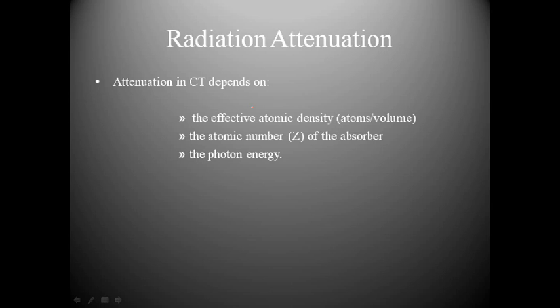It has attenuated more X-ray photons than the bone, the air, and all of the other structures in the pelvic area. The material the belt buckle was made of has a very high Z number, and because of that it attenuated more X-ray photons than the other things in the image.